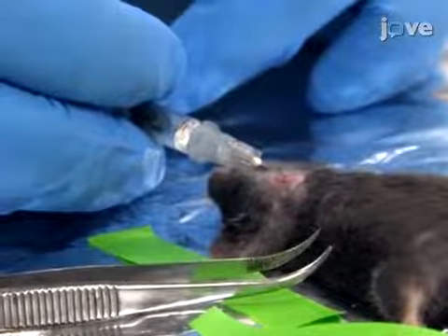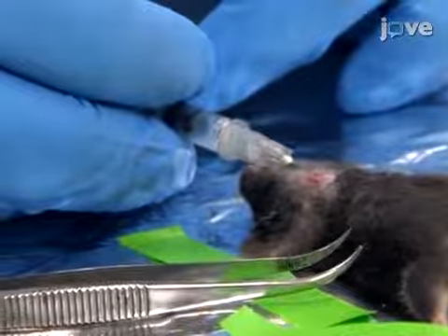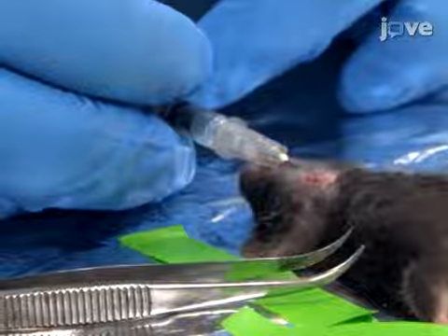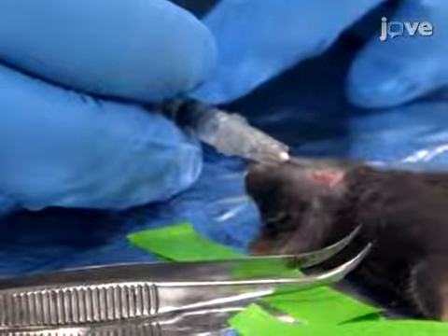The major advantage of this technique is that it is very efficient and highly reproducible because of the direct delivery of the bacterial inoculum into the lower respiratory tract.